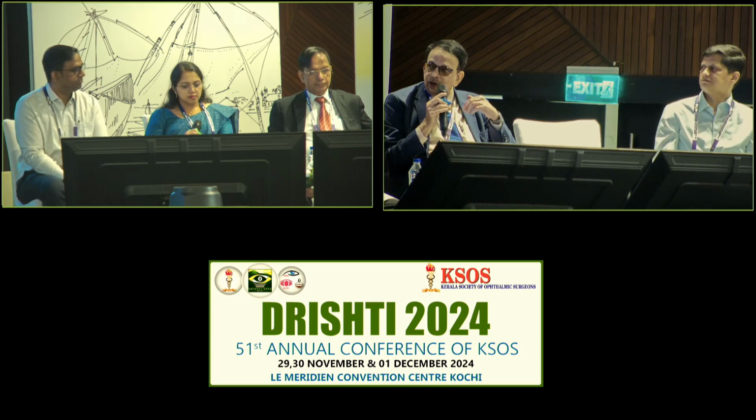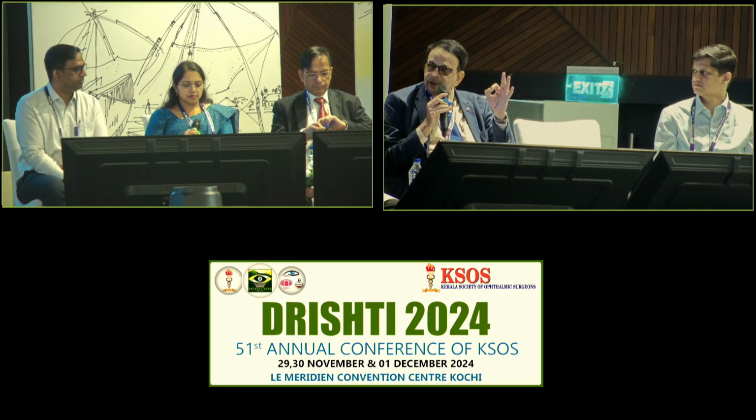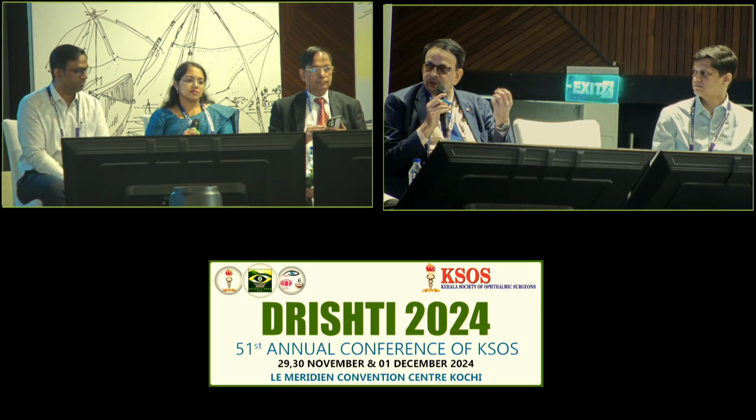Even in the presence of corneal haze, I use the endo illuminator, or you can use a chandelier also, if you have access to it. But an endo illuminator, I'm sure everybody can get that. It's not a very big issue.